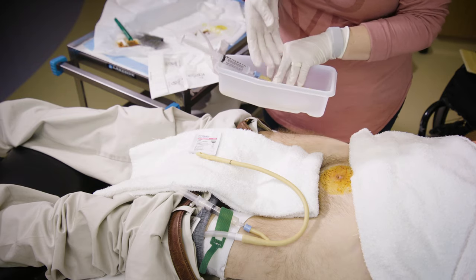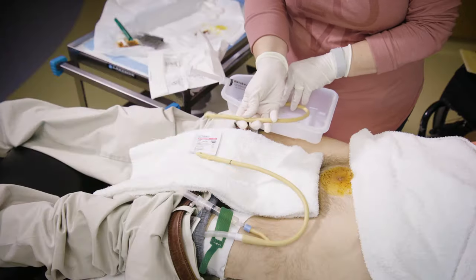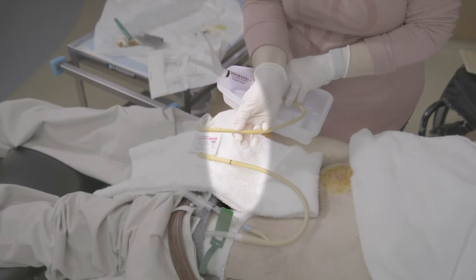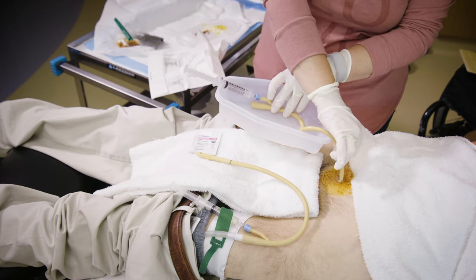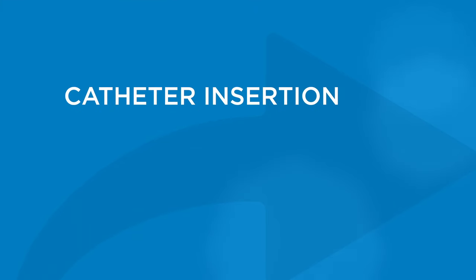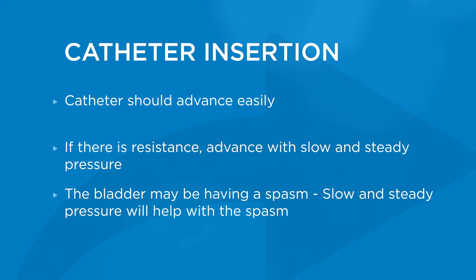Place the new catheter next to the old catheter, but do not touch the new catheter with the old catheter. While both catheters are side by side, move your finger and thumb to the same length as the marked position of the old catheter. Keep your finger and thumb on this position while inserting the new catheter. Now insert the new catheter into the person's insertion site. Gently advance the catheter forward until your finger and thumb come in contact with the person's body. The catheter should advance fairly easily. However, if you run into resistance, advance with slow and steady pressure. The bladder may be having a spasm; the pressure may help in easing the spasm.